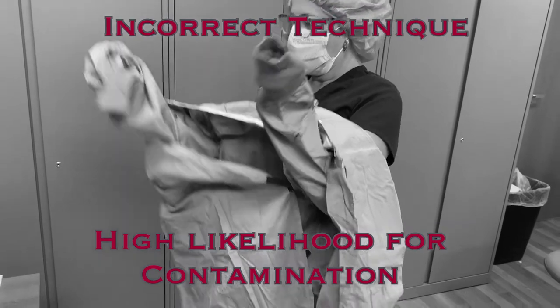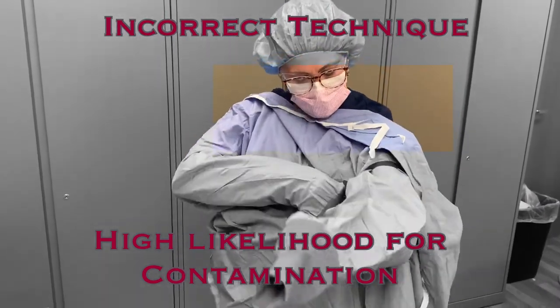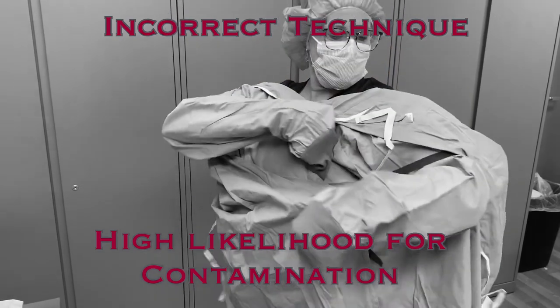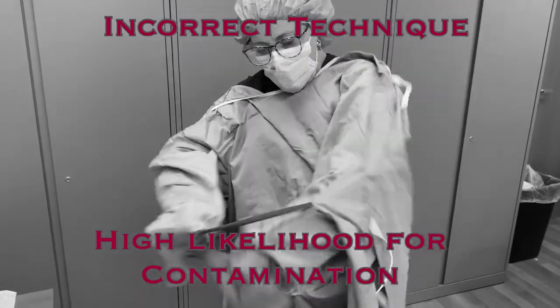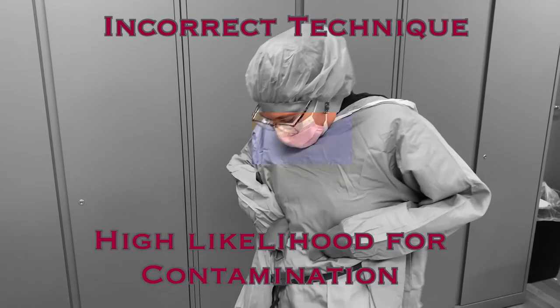Another issue is extending your arms with the arm below the ties. This will also potentially lead to contamination of the gown because it will require a lot of unnecessary movement to free your arms. Donning the gown in the correct way will eliminate the need for any additional movements and minimize the risk of contamination during this process.